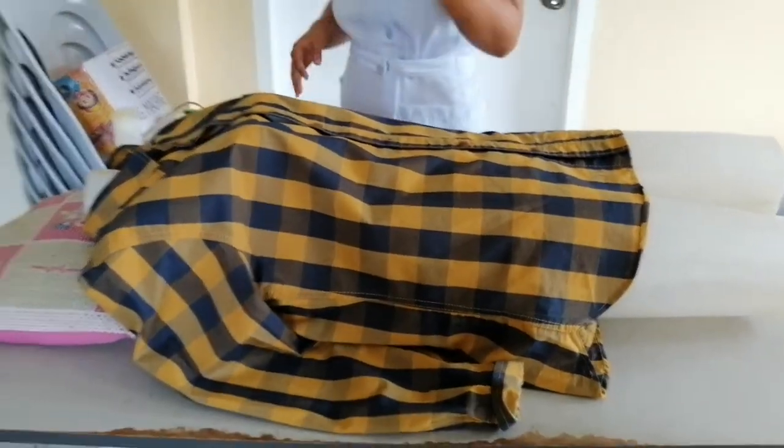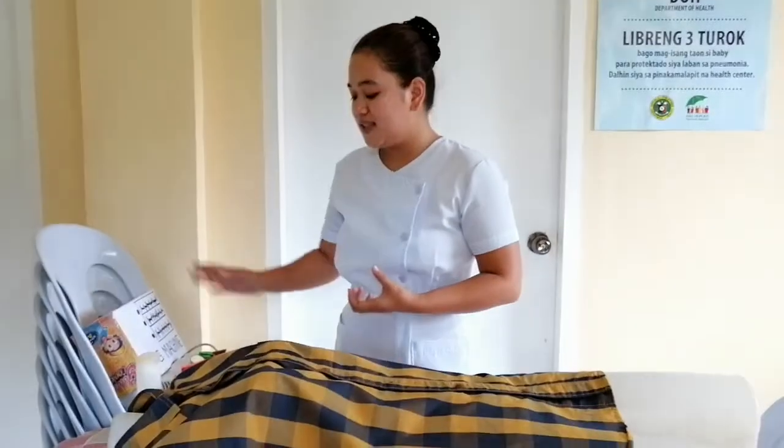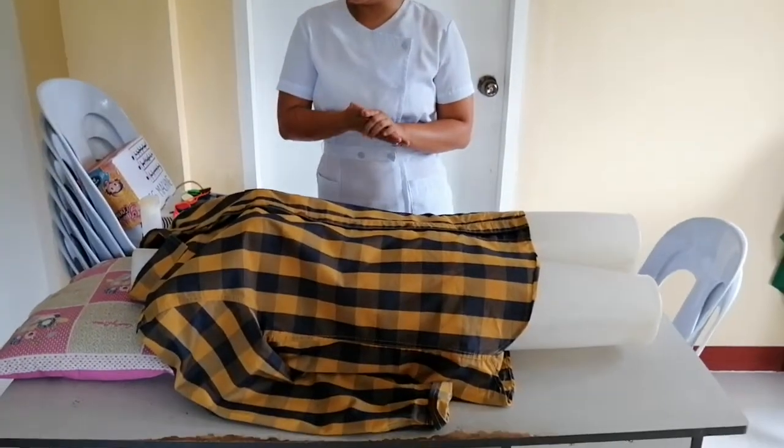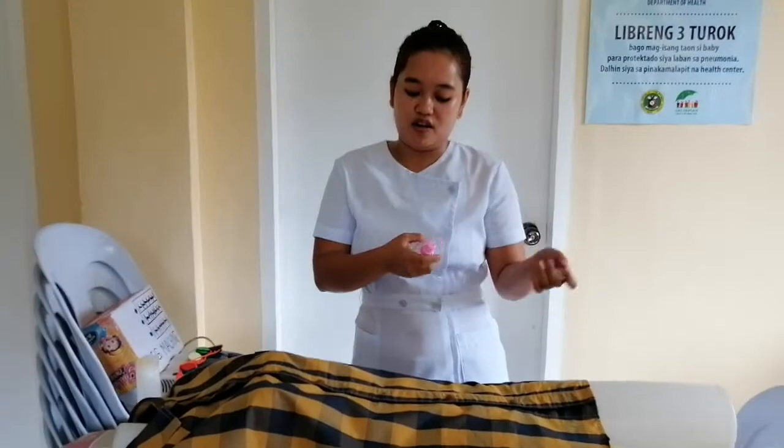And then we're now going to perform the procedure. But first and foremost, before we place the leads on the chest of the client, we need to sanitize our hands. If soap is not available, we need to make use of alcohol.